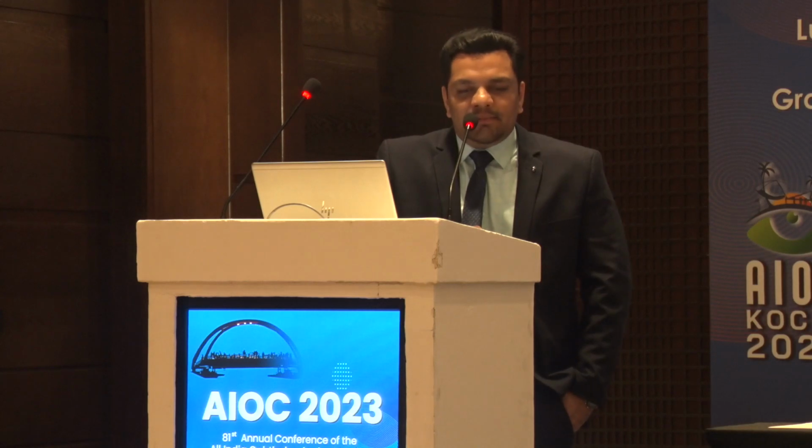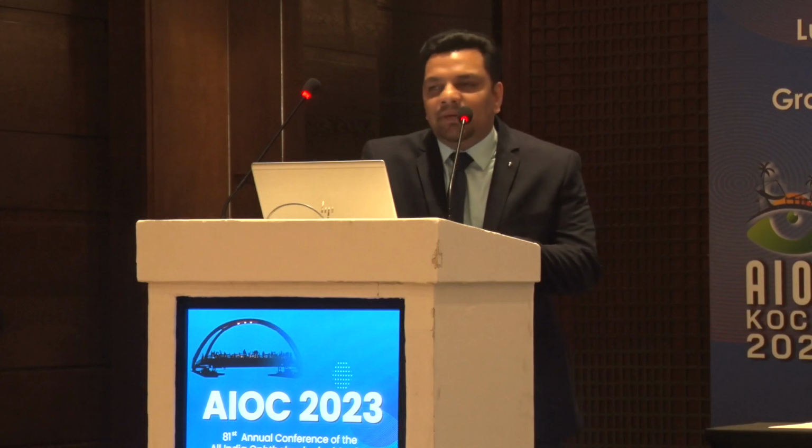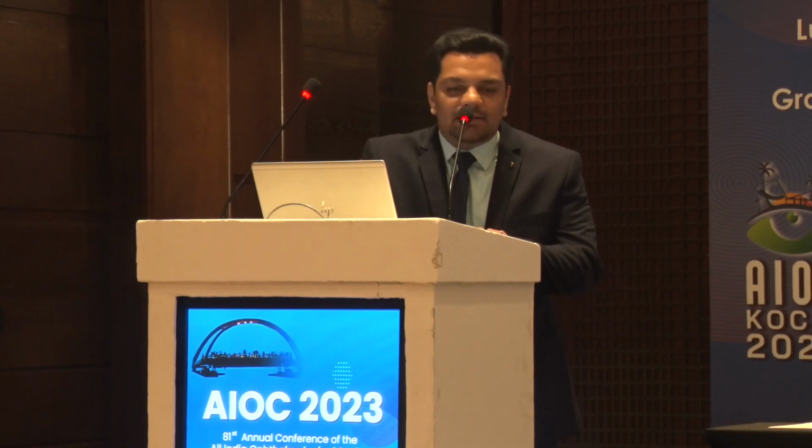And after the vitrectomy is completed, like Dr. Vaibhav mentioned, you should always check the retinal periphery. So I check the retinal periphery, and additionally I do 360 degrees endolaser, because one of the main problems with SFIL which I have experienced during my fellowship is retinal detachments, and it's extremely difficult to manage once you have RDs happening due to secondary IOL.